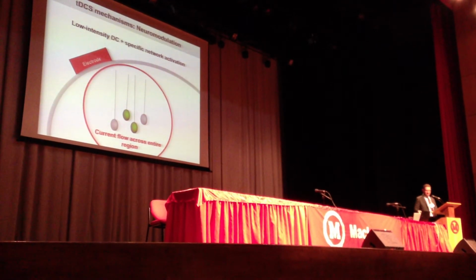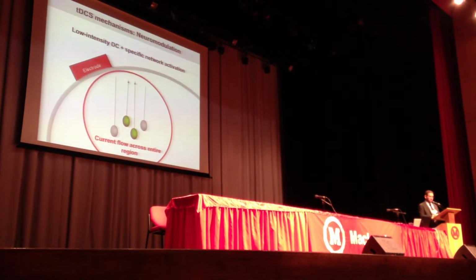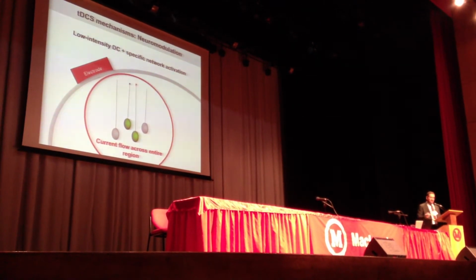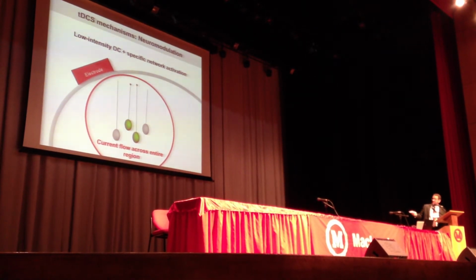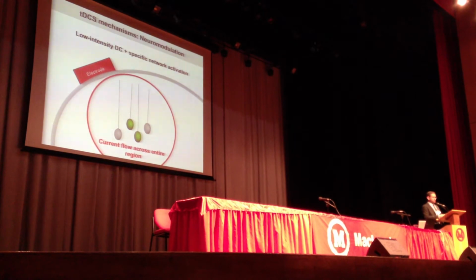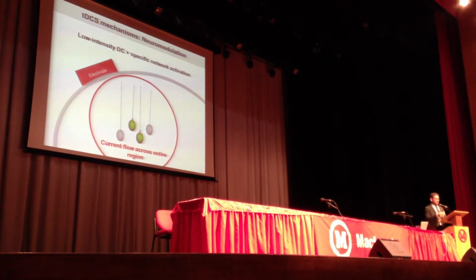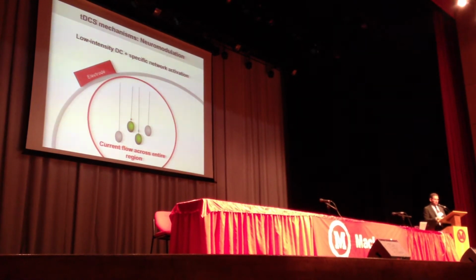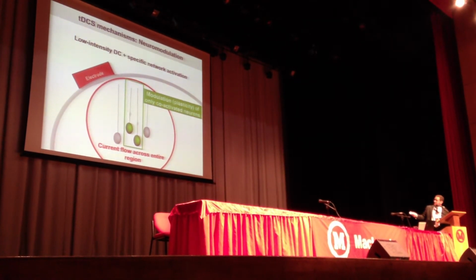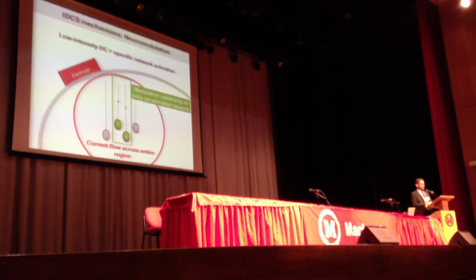But as I mentioned, a lot of tasks are done in combination with behavior, right? There'll be a behavioral intervention combined with the tDCS, which makes one part of this broader brain, one network, more active, right? I'm actually showing this as outputs, but really this system here is now receiving more inputs. So if it's the network of the brain that's involved in reading, right? That network is now receiving more inputs as it's trying to process this reading information. And even in the case of the MEP experiments, you're probing that particular system. You're sending inputs to that particular hand knob to try to activate it. And so the broader hypothesis is that specificity can arise because only the co-activated network will be modulated. Because it's the only part of the brain that's receiving a particularly elevated amount of input.